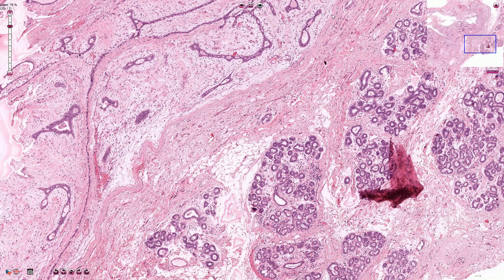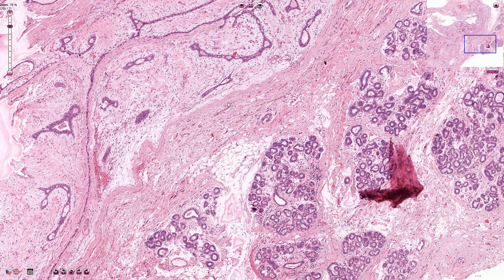Here we have the clear border between the fibroadenoma and the adjacent breast tissue — it is quite clear and sharp. Macroscopically, fibroadenomas are usually well-circumscribed lesions with a smooth surface and they are mobile lesions, unlike carcinomas, which are associated with infiltrative type of growth and the border between carcinoma and the adjacent breast tissue is usually not clear.